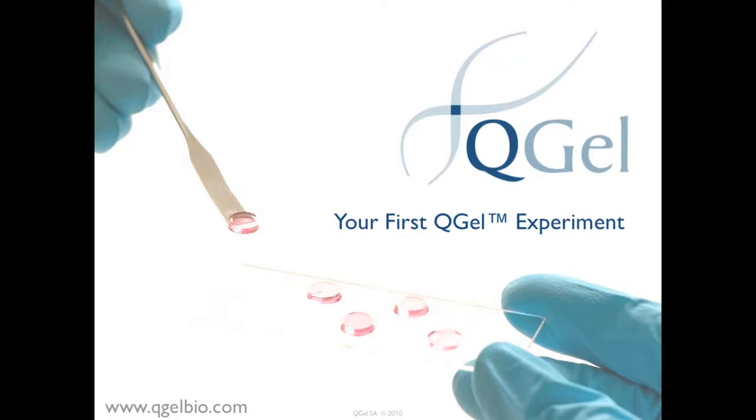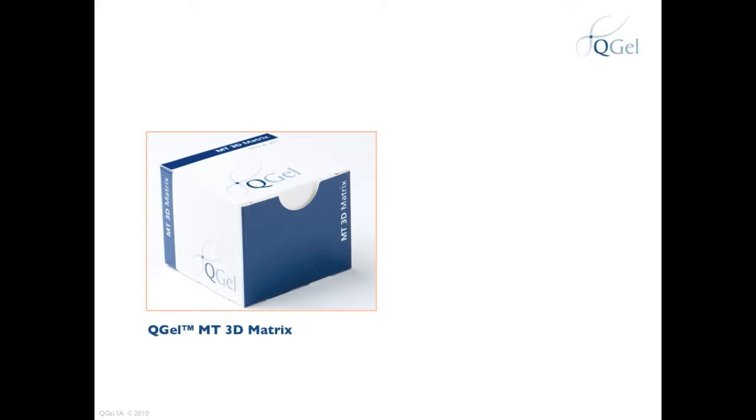This video shows you what to expect when you receive QGEL for the first time. QGEL MT3D Matrix is delivered in a dark blue box that looks like this. Because QGEL MT3D Matrix is a lyophilized powder, make sure that you order QGEL Buffer, which is a liquid, when placing your first order, or make sure that you have enough QGEL Buffer in your stock room to perform your experiment. QGEL Buffer is delivered in a light blue box that looks like this.